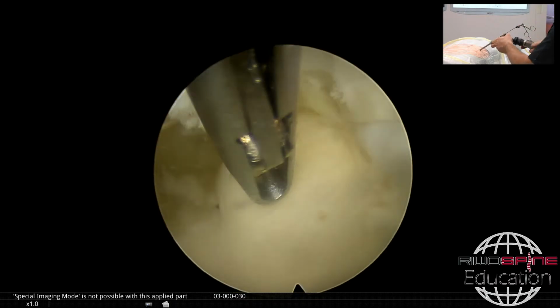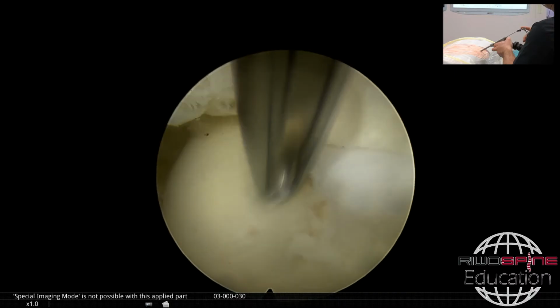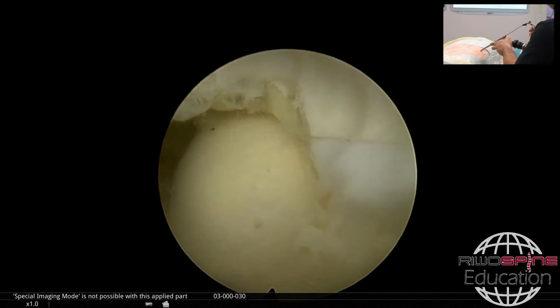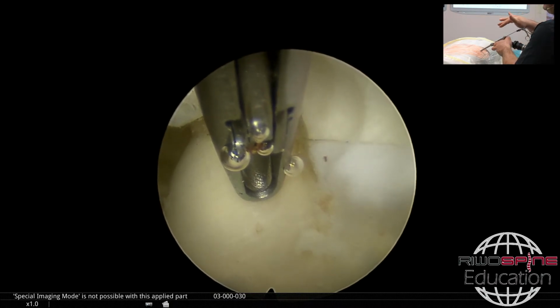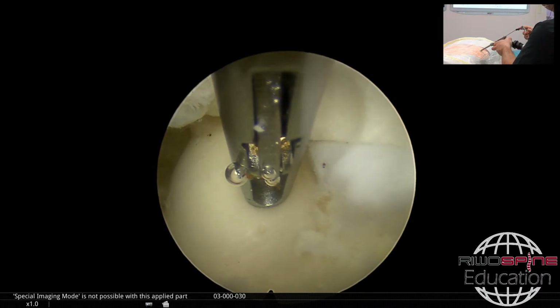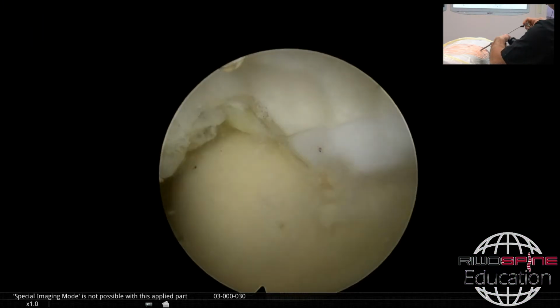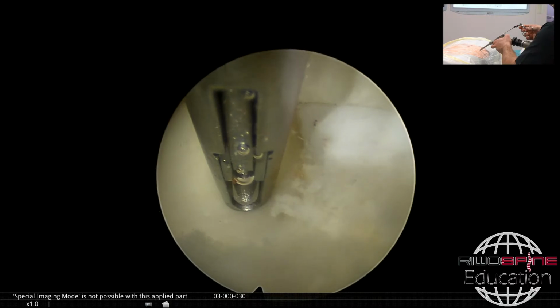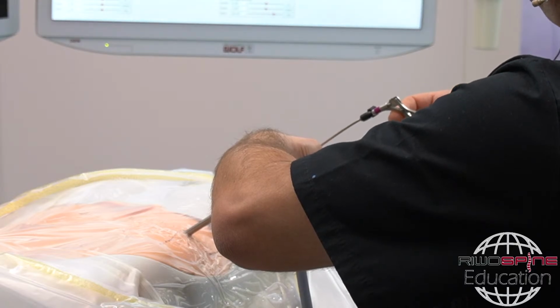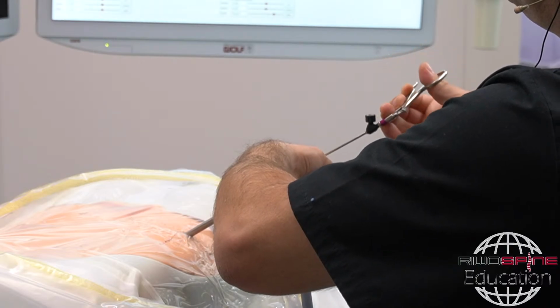I would like to show you another maneuver also here. The working channel is located eccentric, meaning not in the center of the optic. Then when I put something in, it comes in front of me, and I don't see what I'm doing. Then I keep the direction of the instrument and rotate the endoscope. I keep the direction of the system, and just rotate the endoscope inside the working sleeve. Then I see what I'm cutting. Then I cut the annulus or the PLL here.